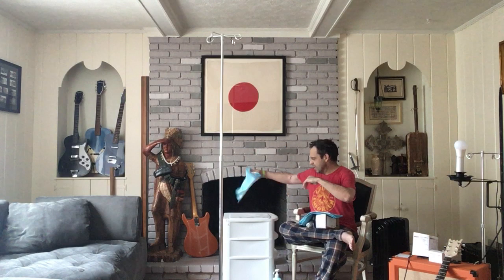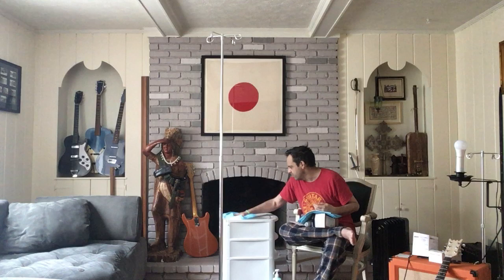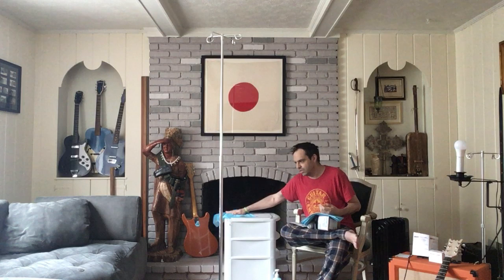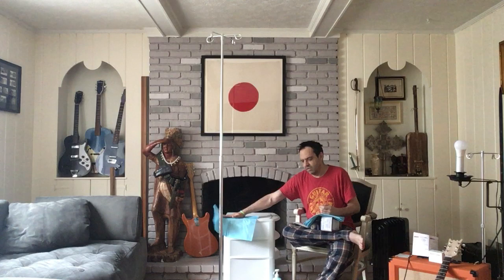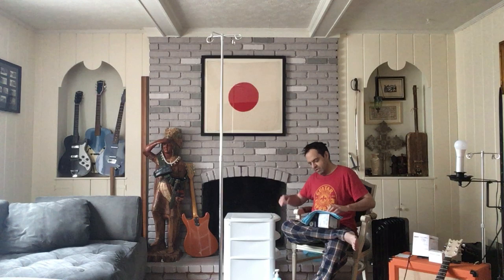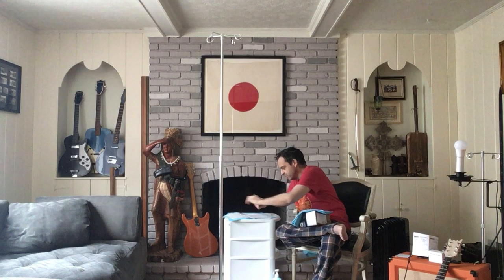So you want to wipe down your area, make sure it's clean, like not dirty. Just make sure there's not dirt or anything hanging out. But you want to sterilize it. Well, it's not sterile, it's clean. Let's make that distinction. Okay, now it's clean. We're going to lay one of these down. This is a sterile cloth. Well, not sterile, clean, right? Get those two words straight.